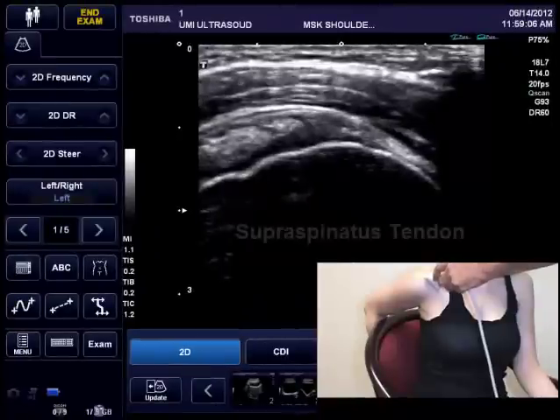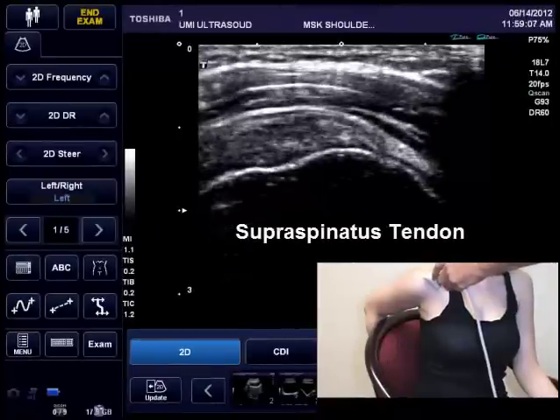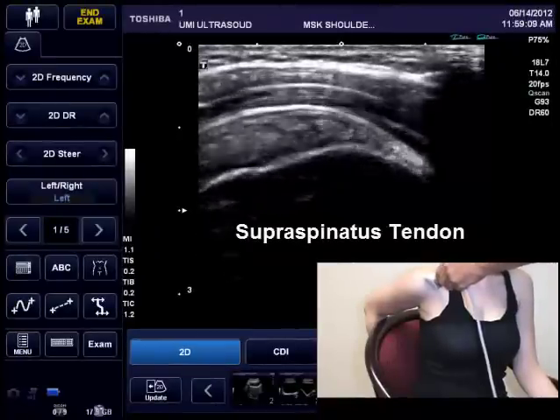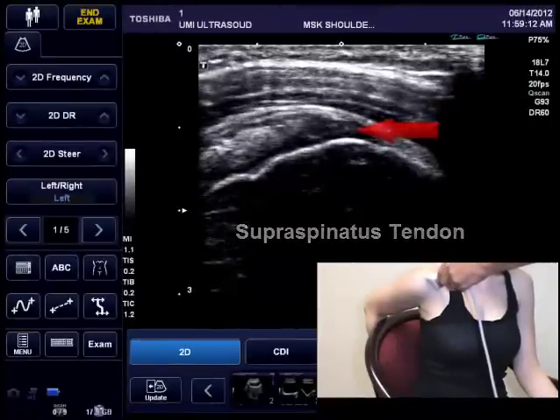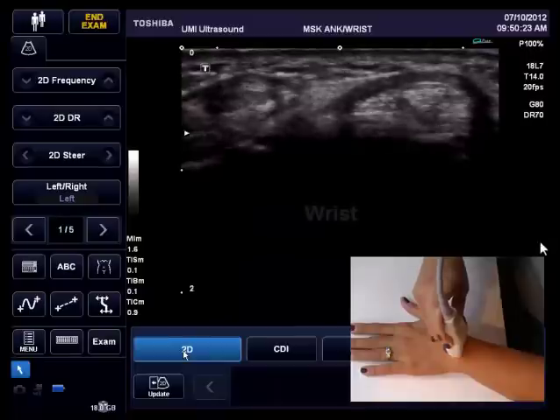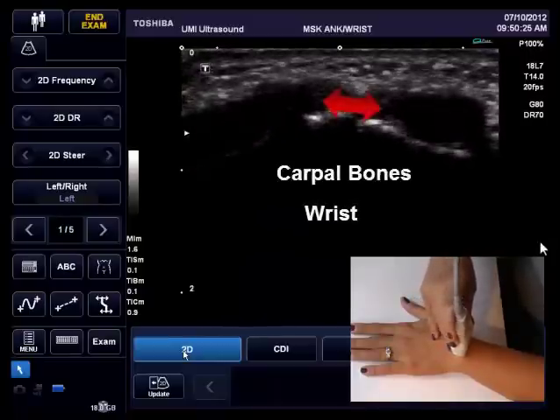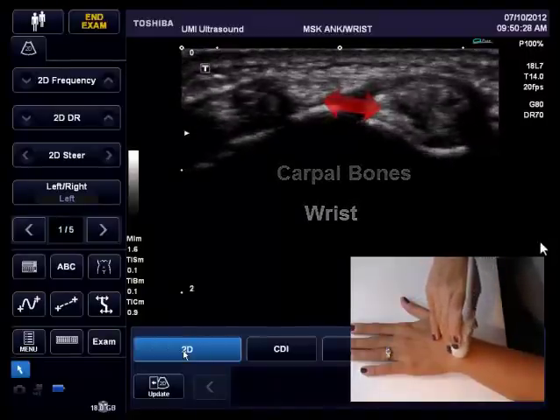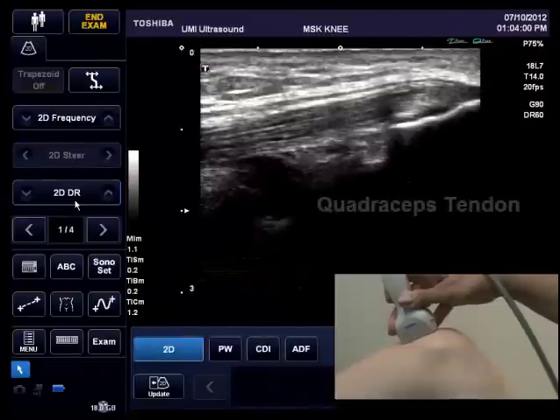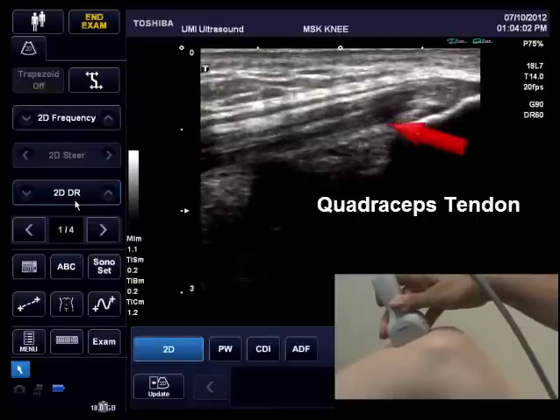Anisotropy is a directionally dependent imaging artifact that occurs when the ultrasound beam is not perpendicular to the structure being examined. This video has examples of the anisotropy artifacts seen while imaging the supraspinatus tendon, the carpal bones, joints, and extensor tendons of the wrist, and the quadriceps tendon of the knee.